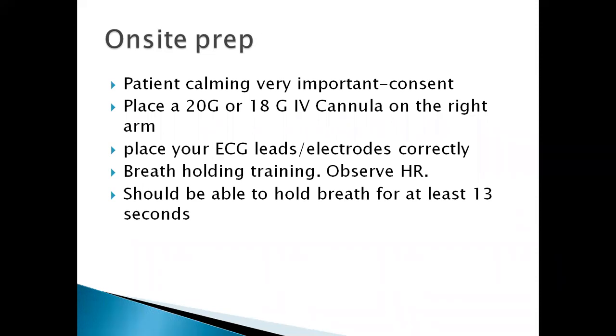Also observe how long they're able to hold their breath. When you ask them to breathe in and hold their breath, ask them to slightly breathe in and then hold, and see how long they're able to do that. If they can do it for 13 seconds, that's even better. Sometimes they can only manage up to 10 seconds, which is also acceptable. But optimally, we prefer at least 13 seconds.